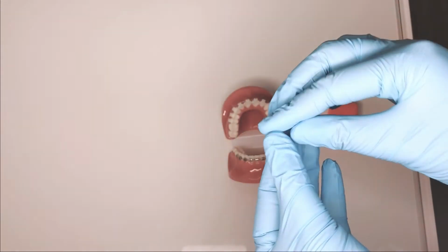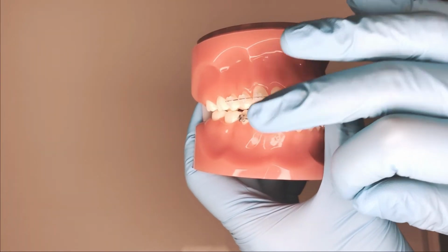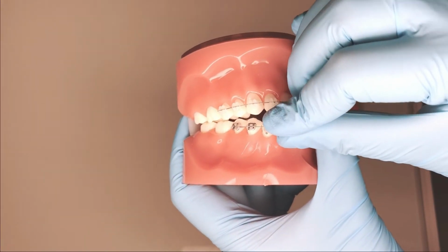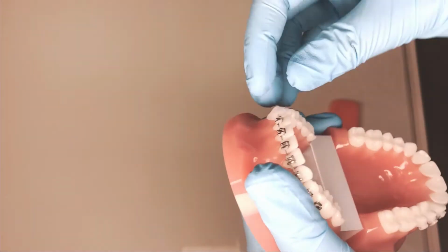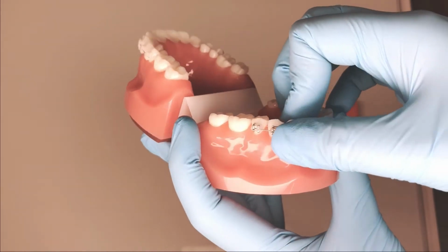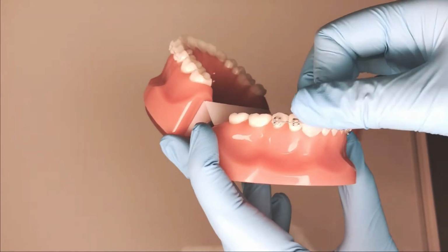Pinch off a small piece of wax, soften it by rolling it between your fingers. Then squish it over the spot that is bothering you. Make sure to mold it around the bracket so it locks into the corners. If the wax has trouble staying on, dry the area before applying it.